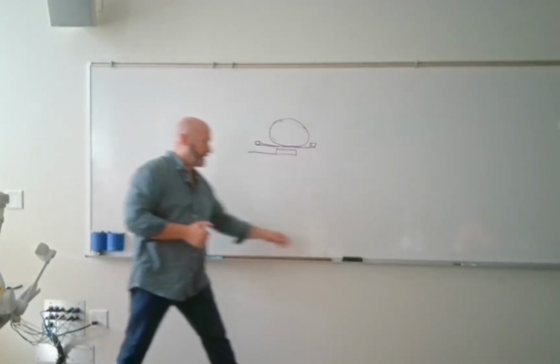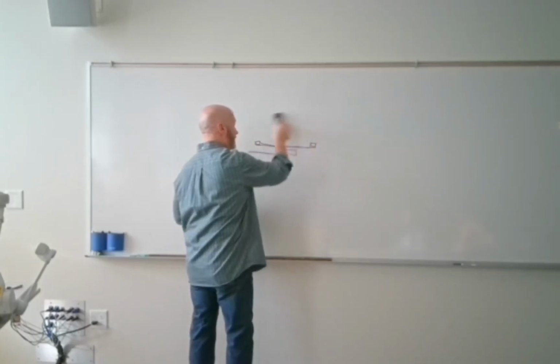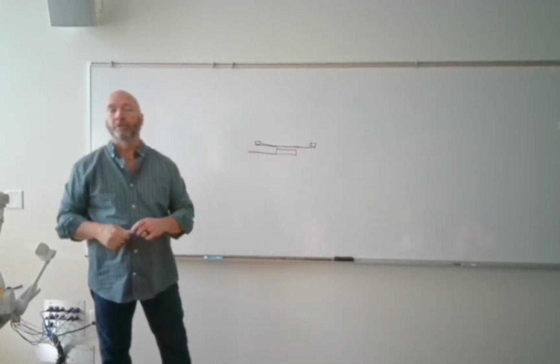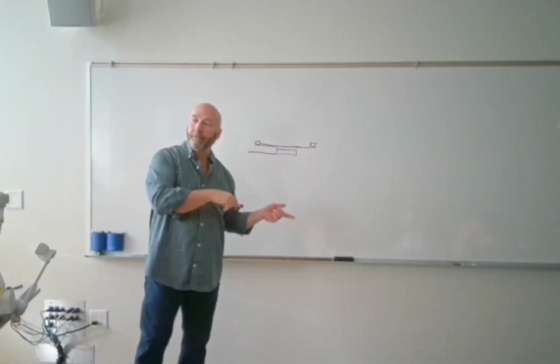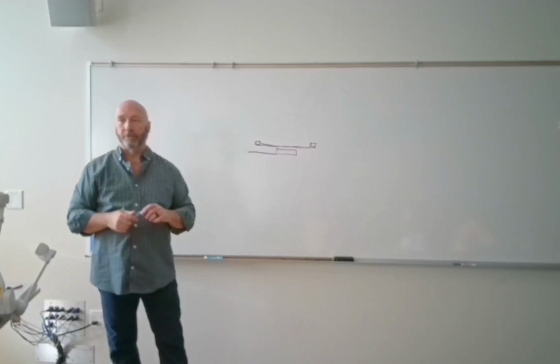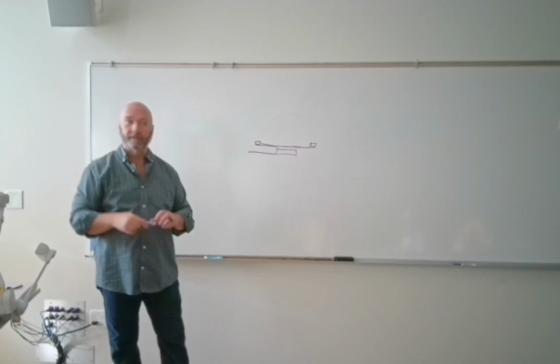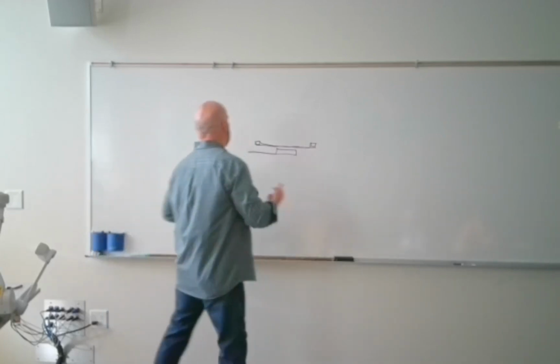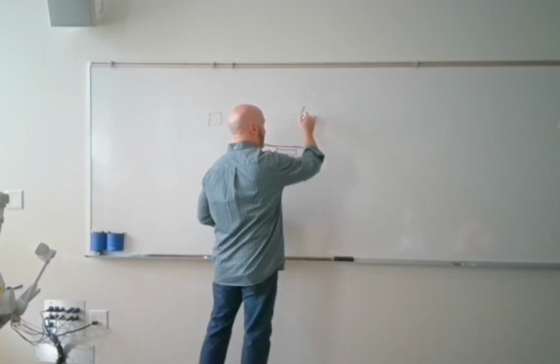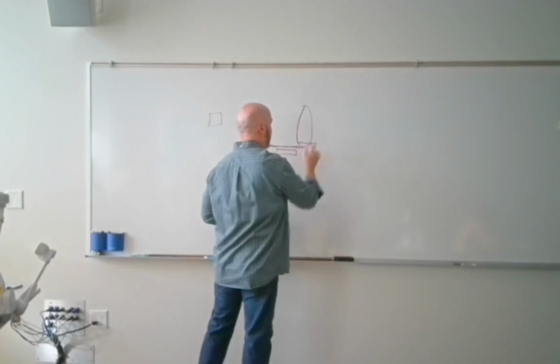Let's say this patient, instead of being an abdomen or a chest supine, let's say this patient has a pleural effusion. Now you're going to have to dip back into earlier in the semester. How do we identify pleural effusion? Decubitus, exactly. So we're going to do a decubitus. Let's say the x-ray tube is over here. And we'll put the patient right here, and their air fluid level is right there.